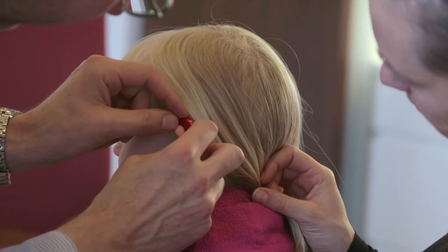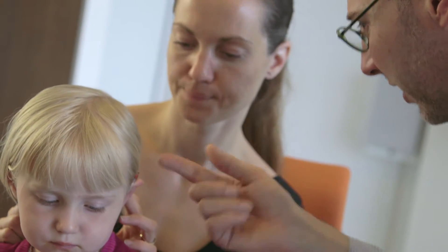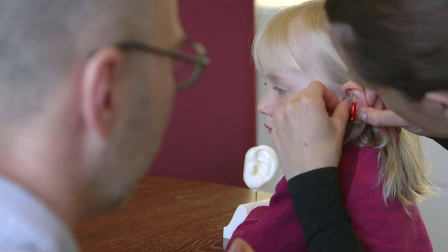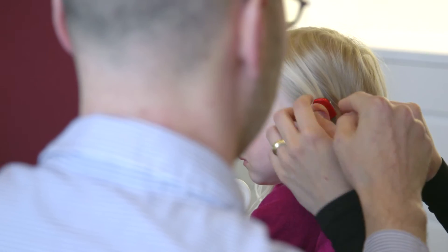Training parents in inserting an ear mould usually takes a few minutes during the fitting appointment. First, the parents need to learn the mechanics of inserting an ear mould, such as guaranteeing that the helix lock is in place. Turning on Smart Fit Trainer can help parents know if they have properly inserted the ear mould.